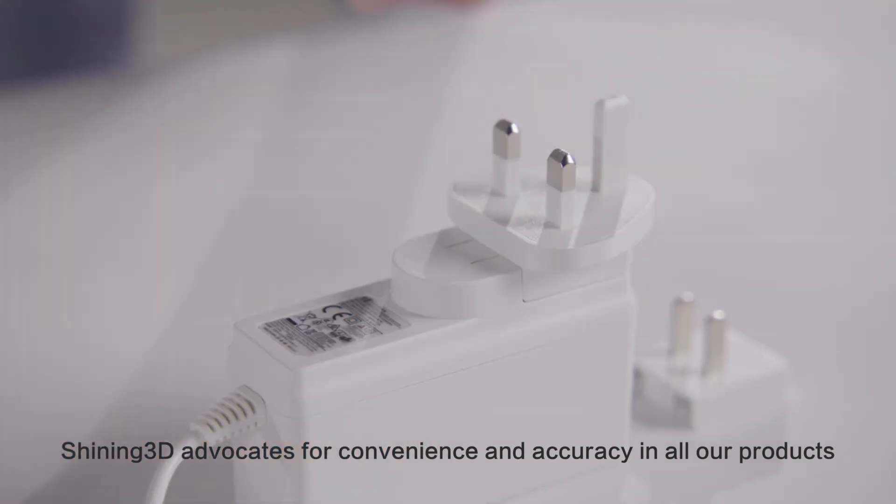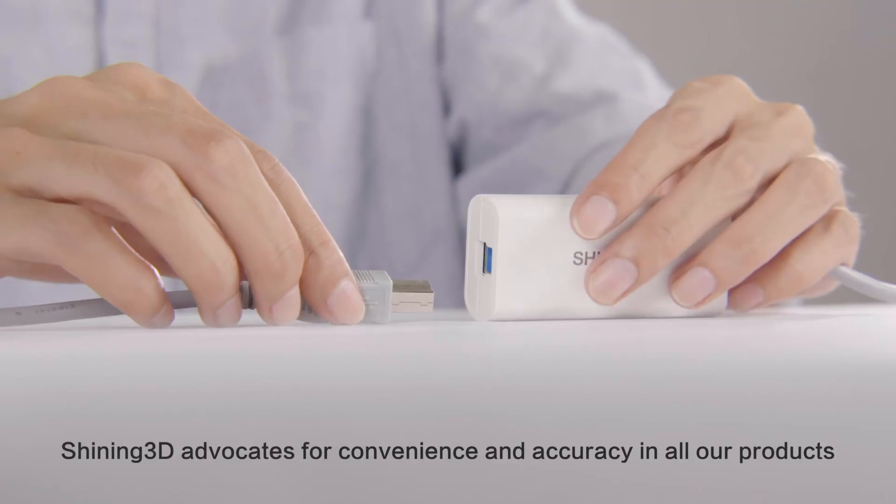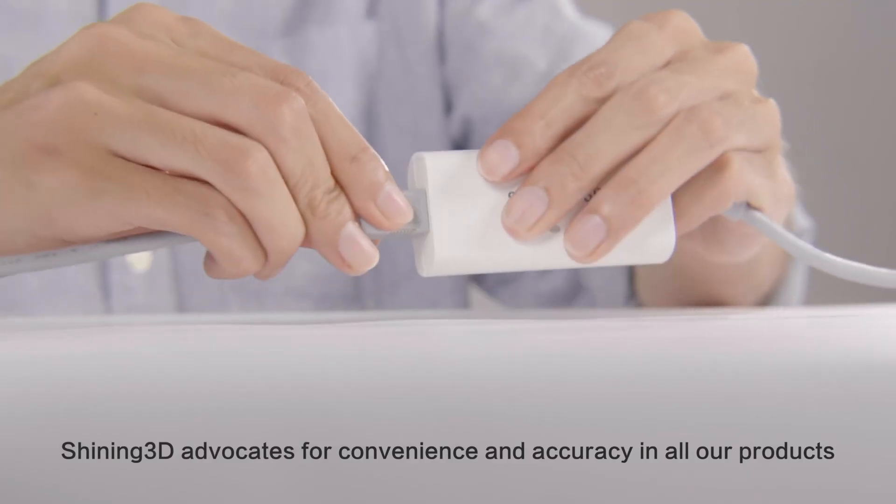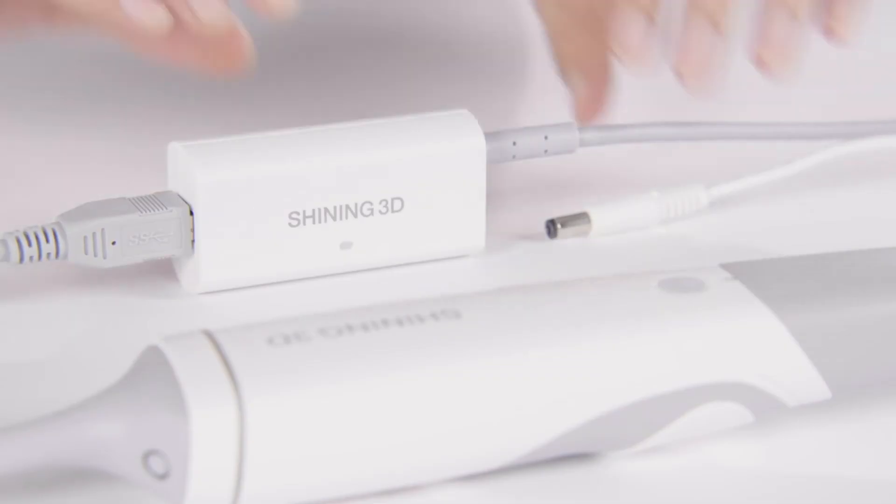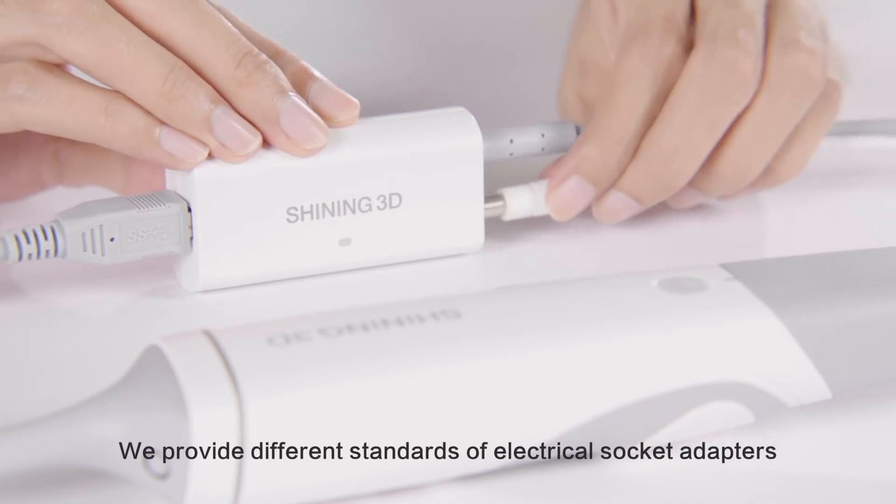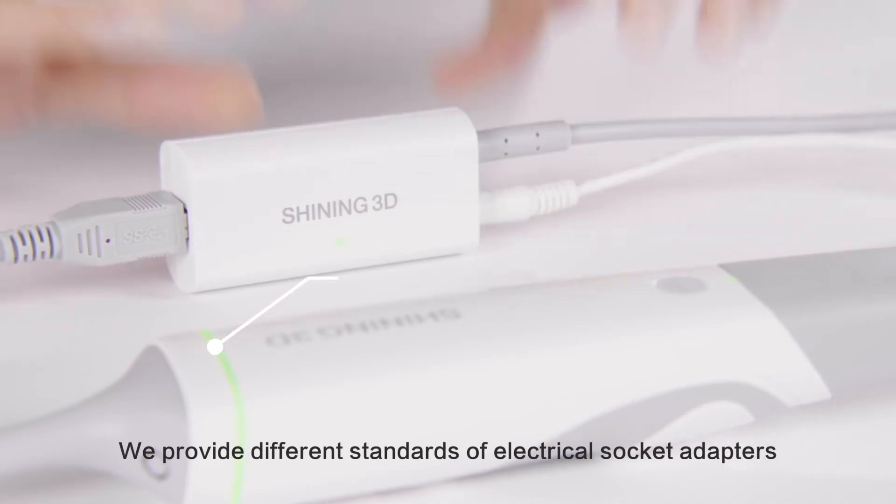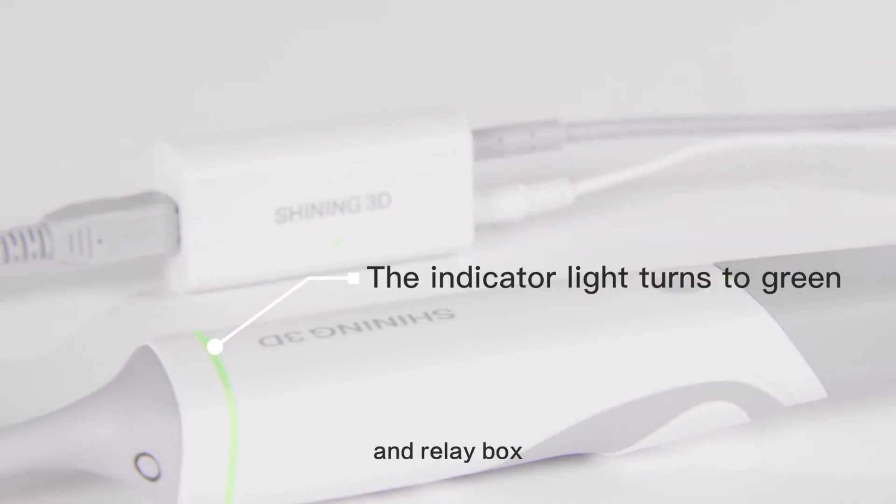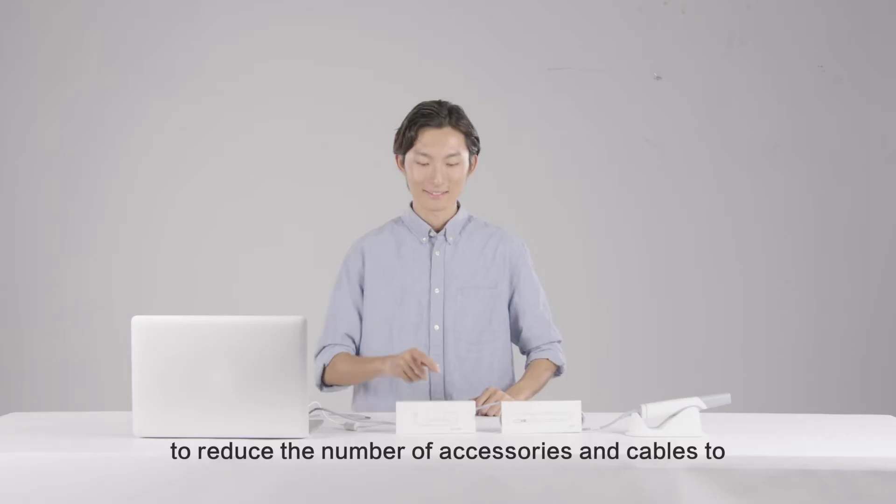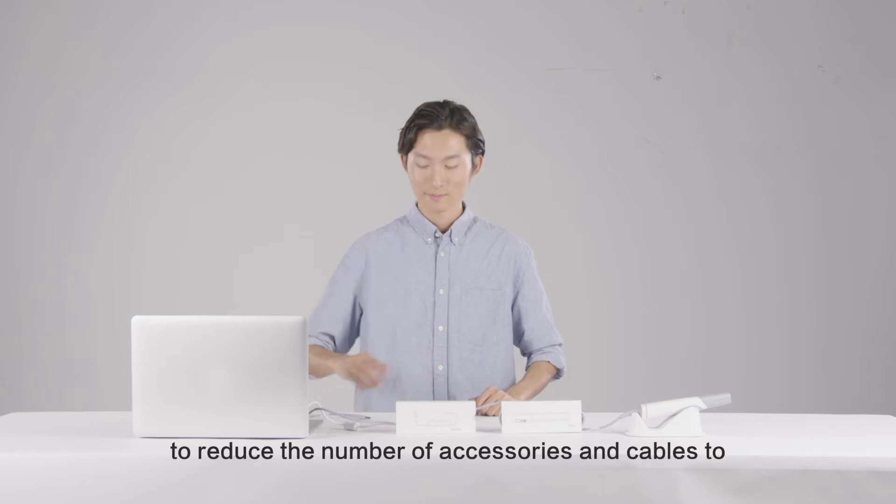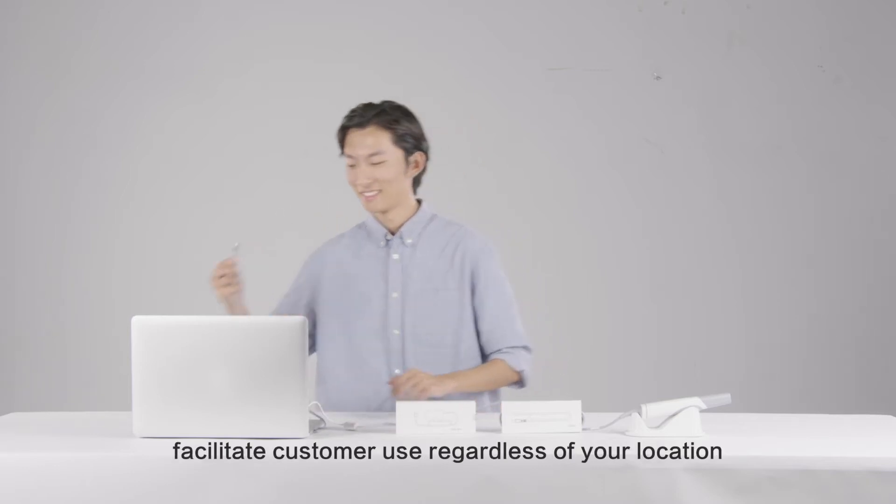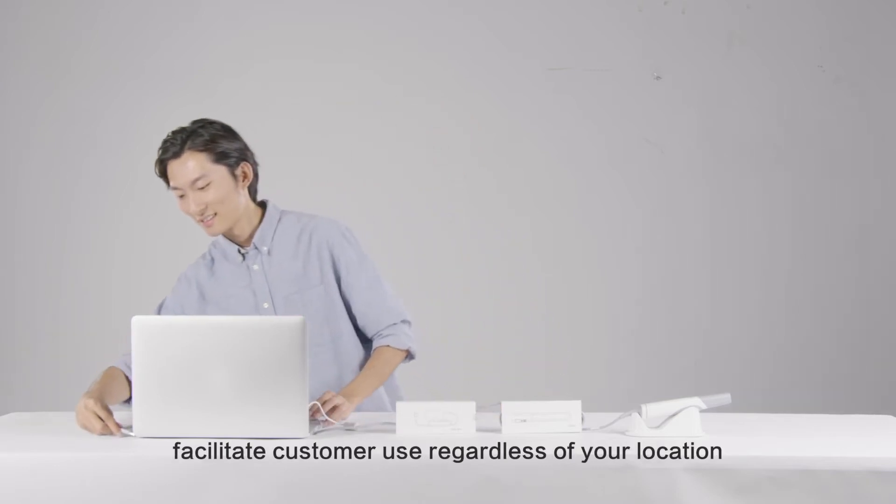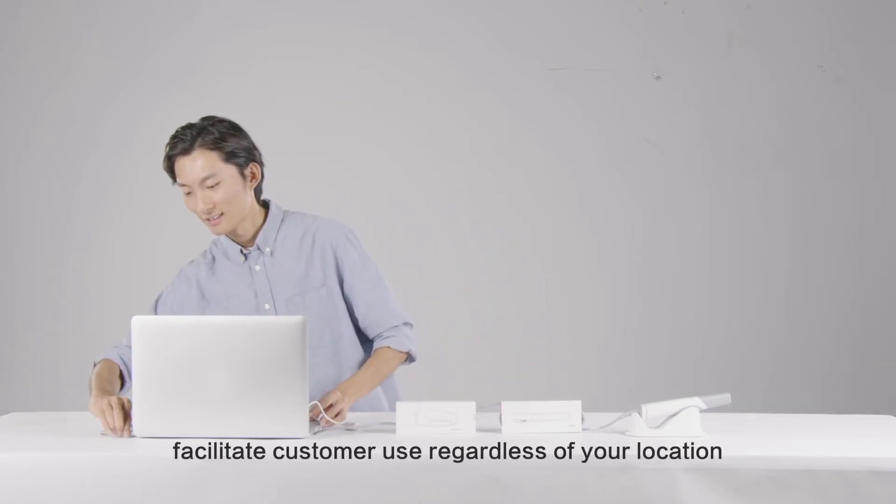Shining 3D advocates for convenience and accuracy in all of our products. We provide different standards of electrical socket adapters and relay boxes to reduce the number of accessories and cables, to facilitate customer use regardless of your location.